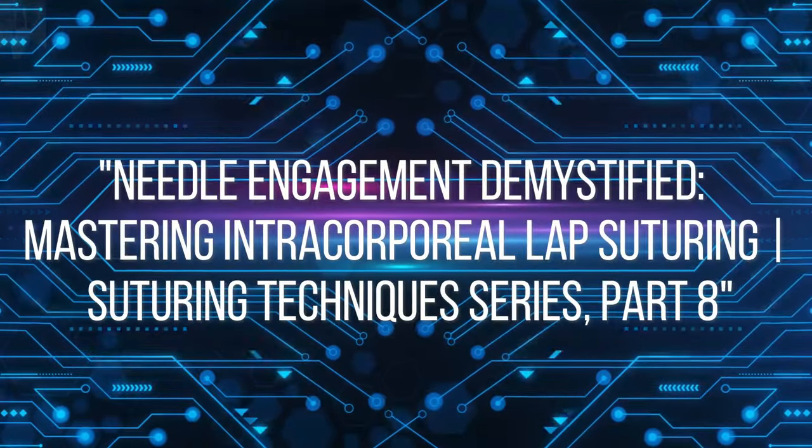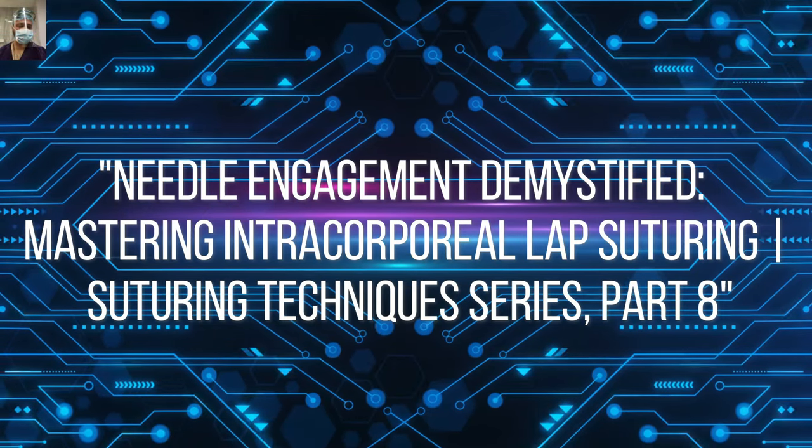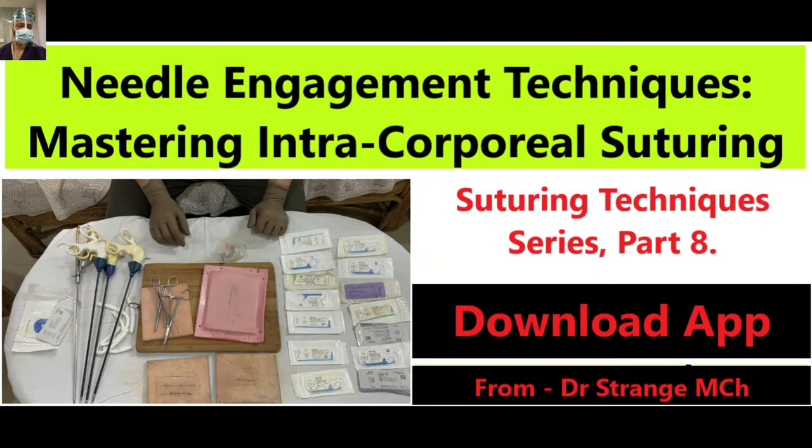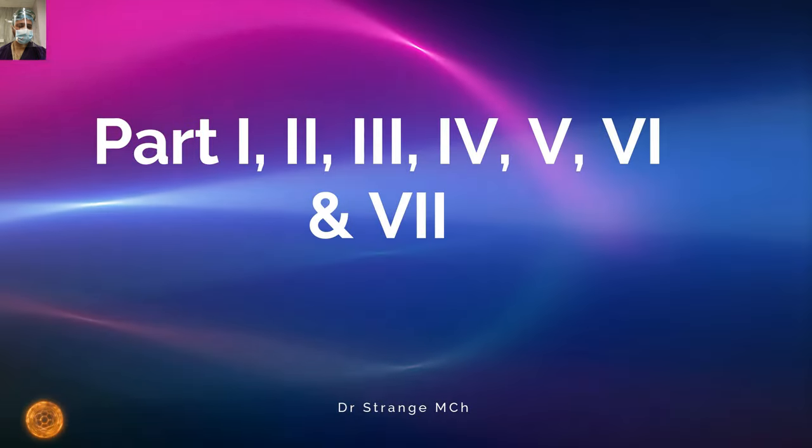Hello future surgical masters. Welcome to a pivotal chapter in our journey through the realm of suturing techniques. In Part 8 of our series, we are unraveling the mastery that lies at the core of intracorporeal laparoscopic suturing: how to flawlessly engage the needle in the needle holder. We will also showcase how much suture length is required during intracorporeal suturing, how to engage the needle, and how to pass the needle across the ports.